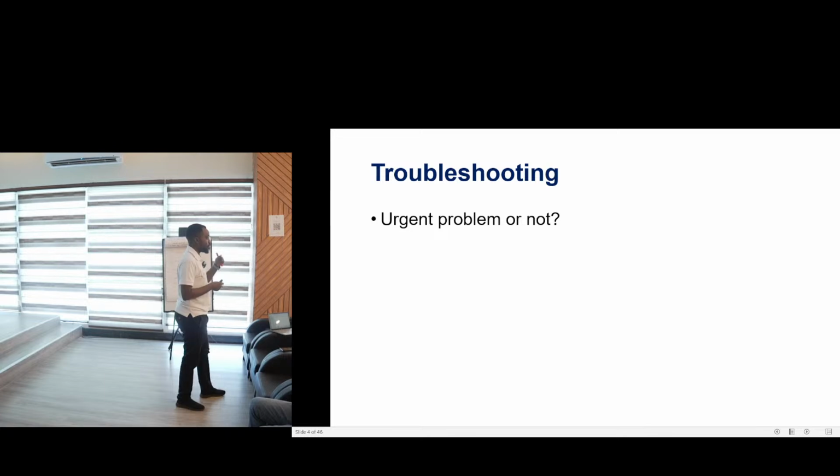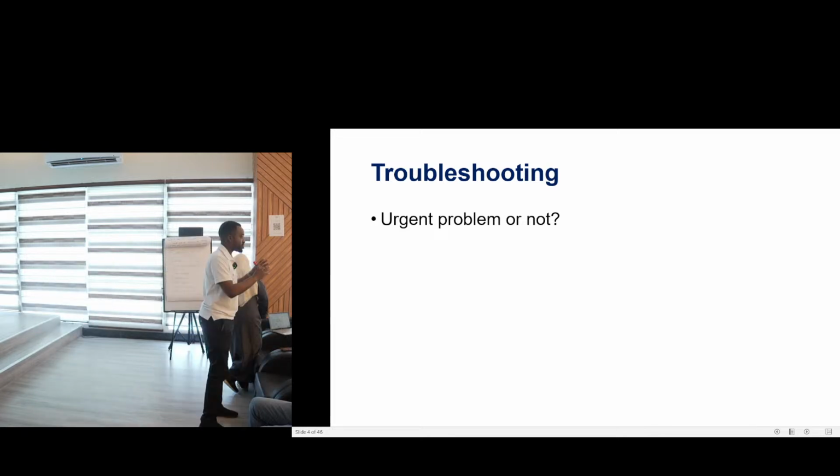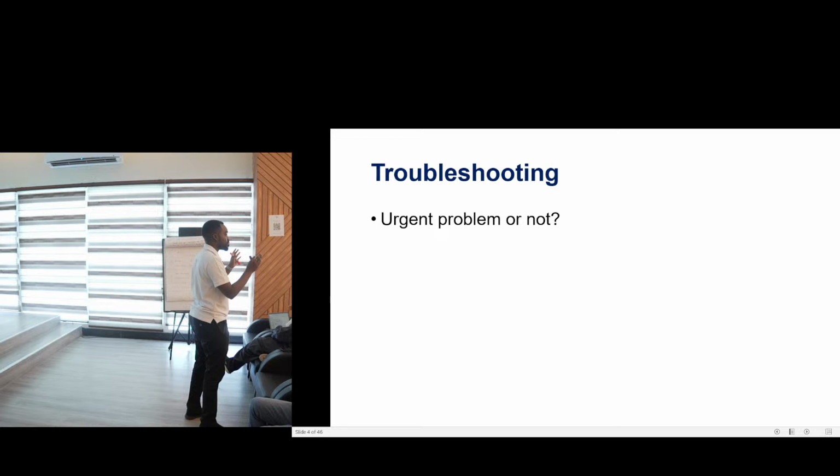You are the first and the last monitor. We have monitors, but you, with your clinical acumen, will be the one to decide whether this problem is urgent or not. If you have a ventilator there, and the alarm goes off, as long as you don't know about it, you won't be able to solve it.